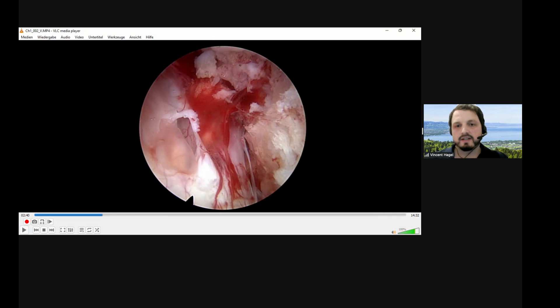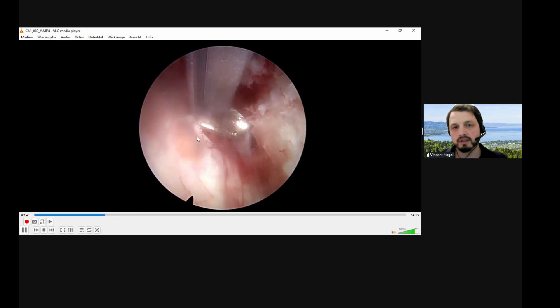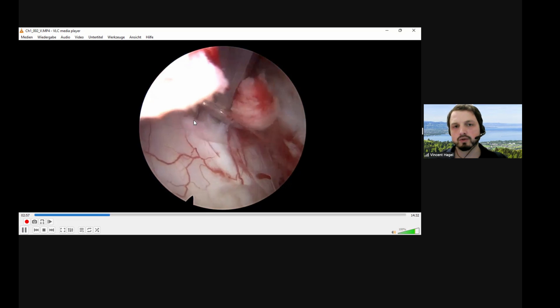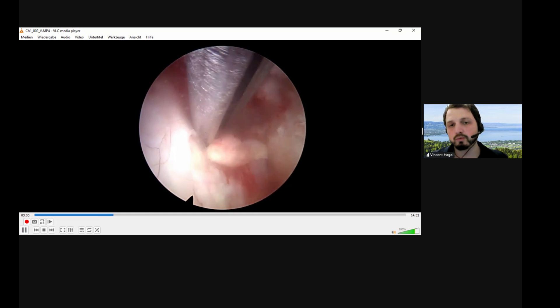This is another case where I also did a decompression at level L4-5. We have a similar view — looking from medial to lateral. Here we see the L5 route running into the lateral recess. Again, looking from medial to lateral for a better view down into the lateral recess. And again, what happened right here is a dural tear, and we see another fascicle right beneath it. Here you do see the fascicle coming out of this defect, at least to some extent — to where in this case I wasn't that sure about not closing it.